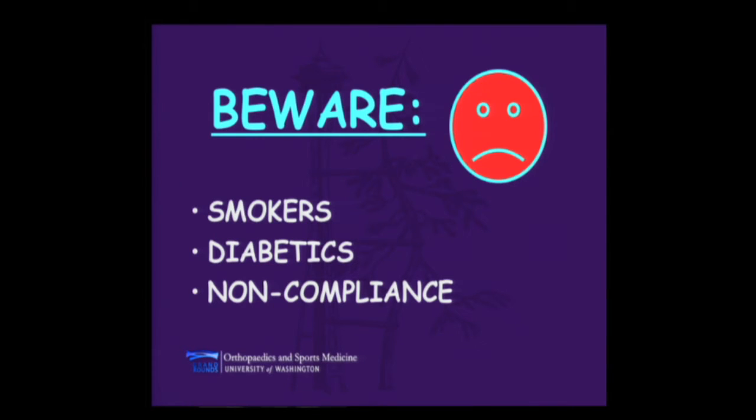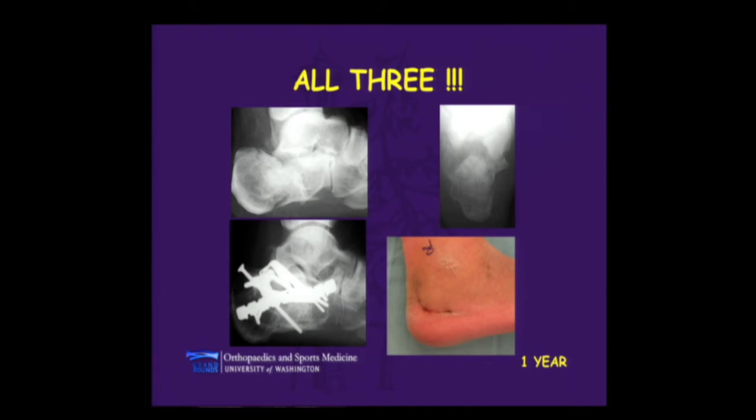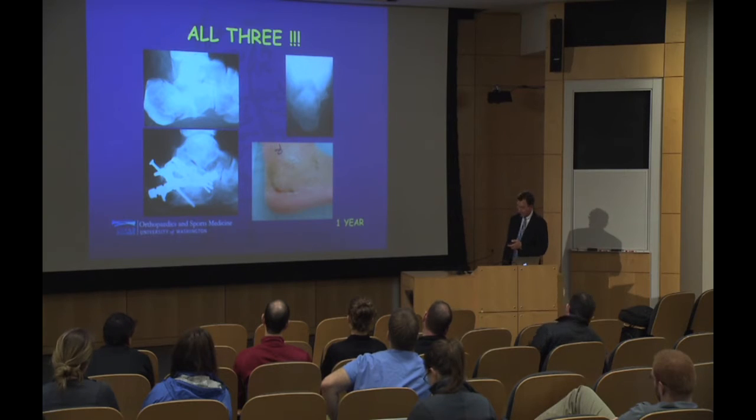The bad, concerning problems that we have are the smoker, the diabetic, and the non-compliant patients. We identified that in our study, and those patients still will come to you, and the question is how you're going to manage them. This is just an example of all 3 of those, and you can imagine if we'd left this alone, it would have been a daunting reconstructive process. I elected to try to manage it, but was unable to manage this without having some intermittent wound drainage here, which necessitated hardware removal, but we were able to maintain the position of his foot. And that's an easier problem to deal with than trying to manage this conservatively and then a later procedure.